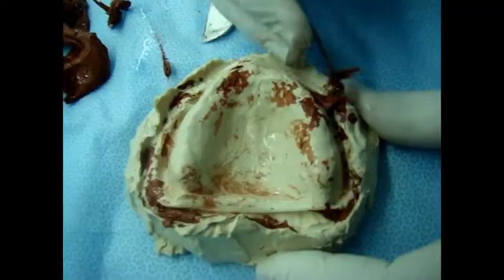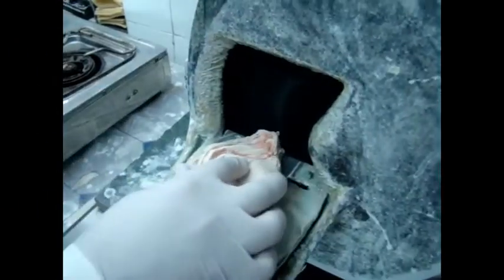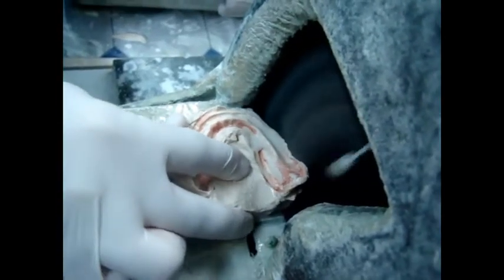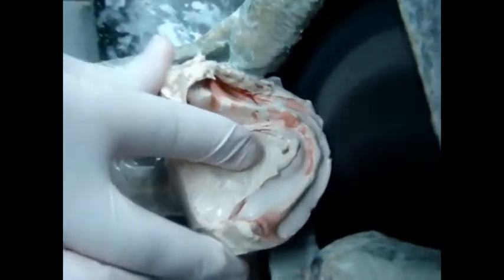All impression compound must be removed from the cast. The surface of the cast must be clean, smooth, with no air bubbles. Now we need to trim the cast. The sides of the cast must be smooth and vertical, leaving a horizontal area around the sulcus called the land area to preserve the sulcus around the cast.